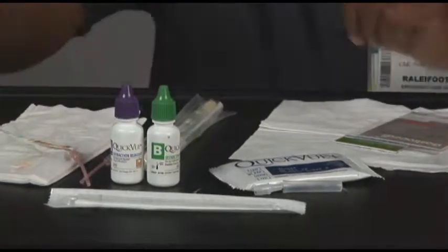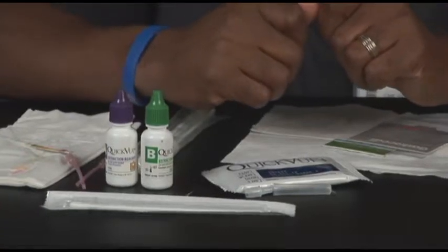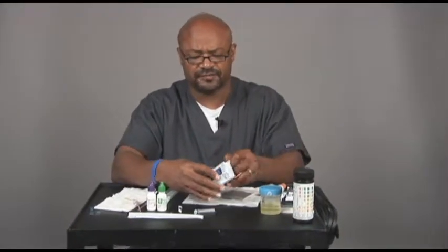For that, you have to swab the back of the patient's throat, make sure you have a tongue blade to push the tongue down. You want to get back there. It's not a nice test, so you should get a gag reflex from them, or if you see some pustules back there, go ahead and swab those. This test, again, you should label it with patient identification.